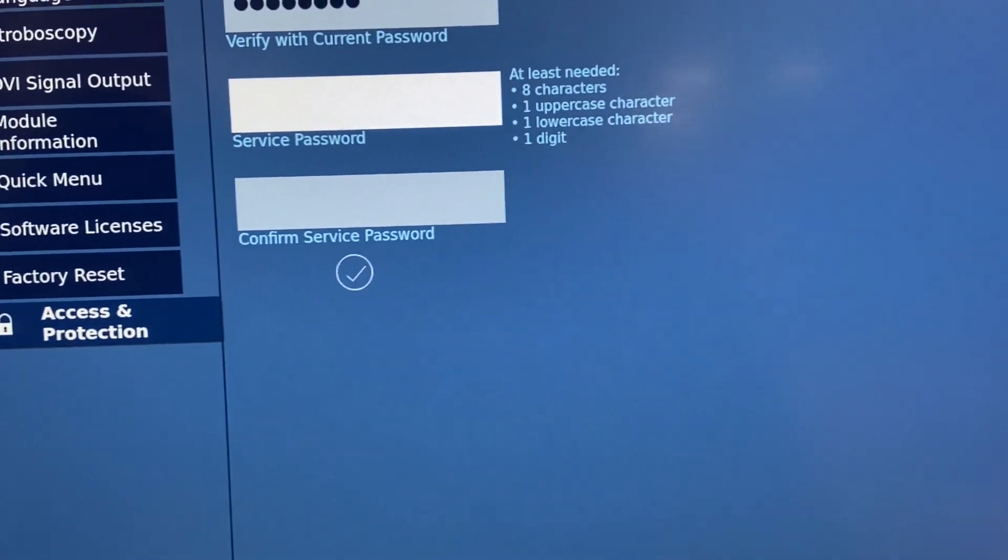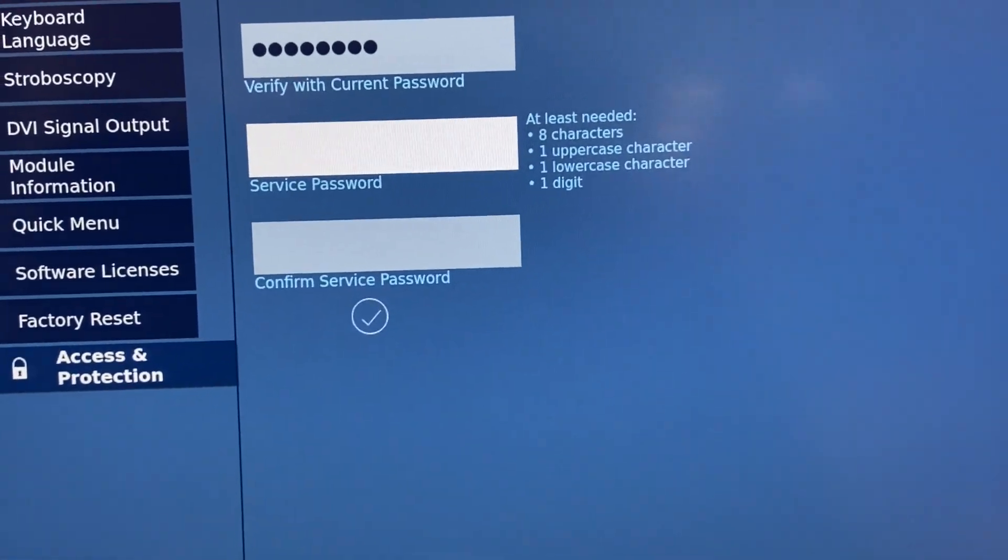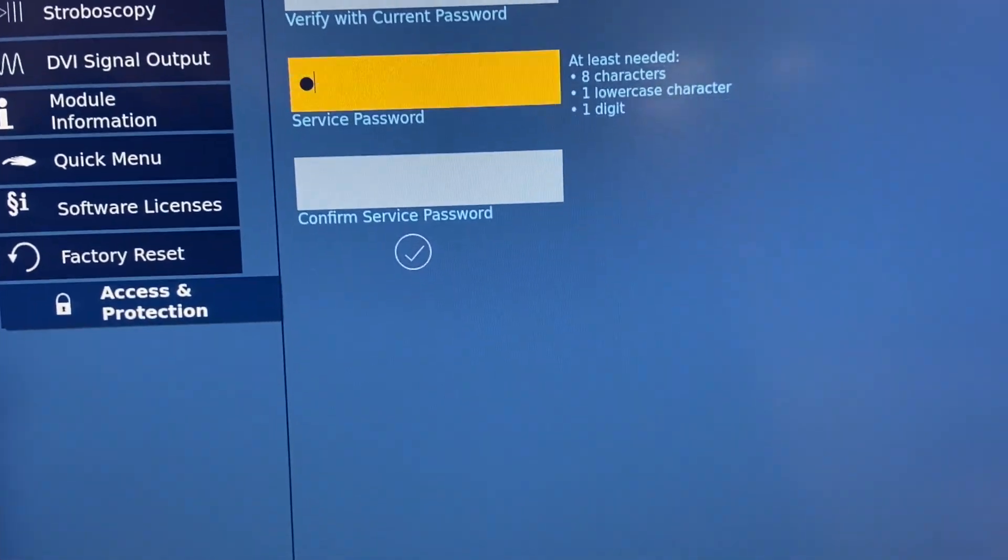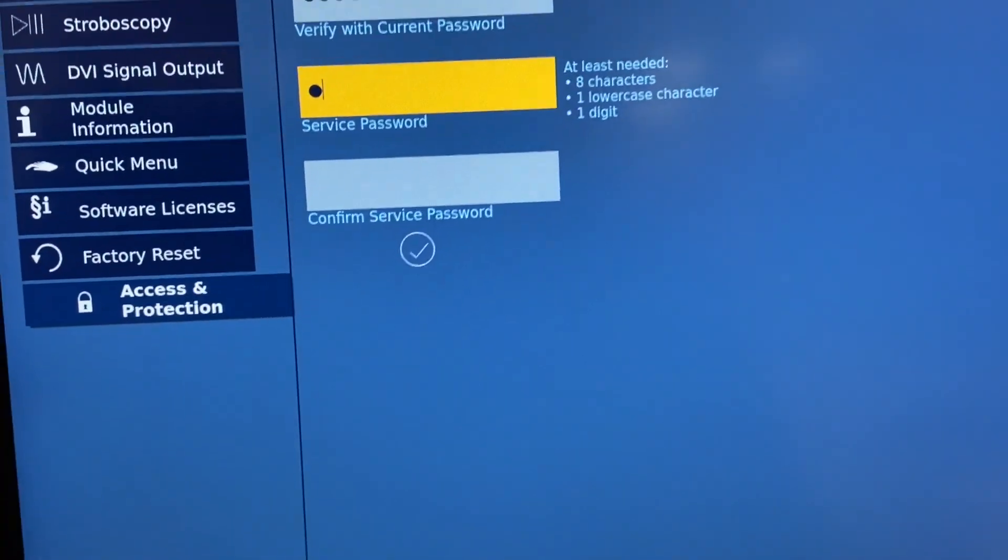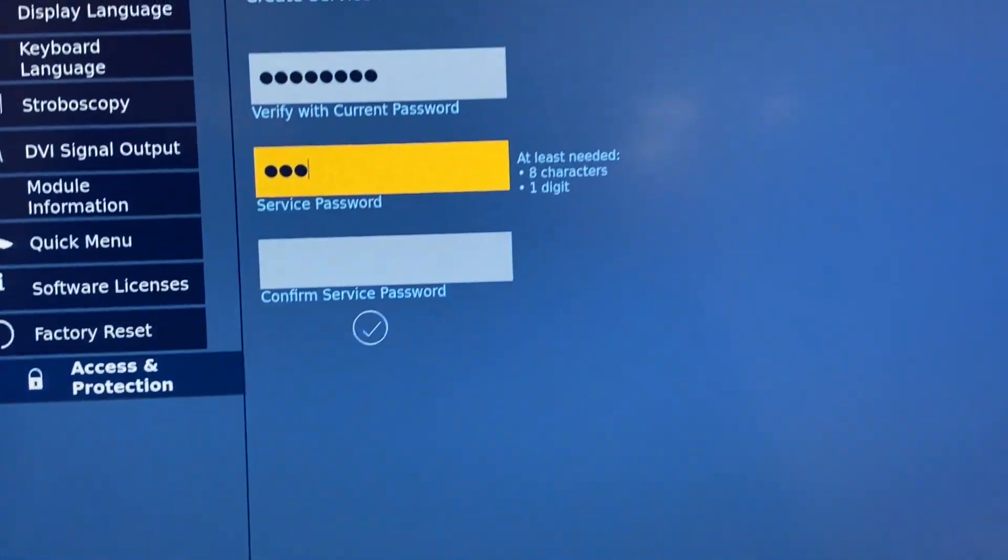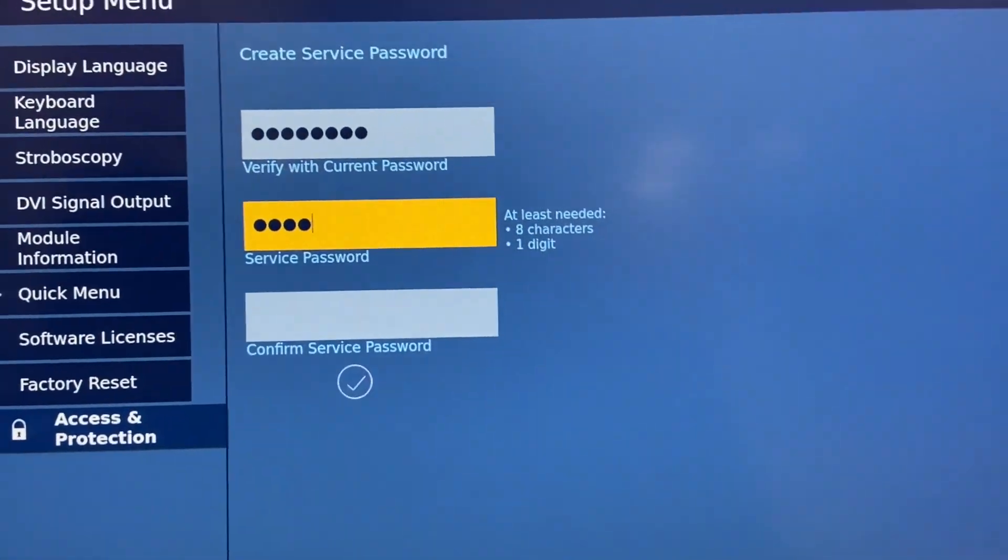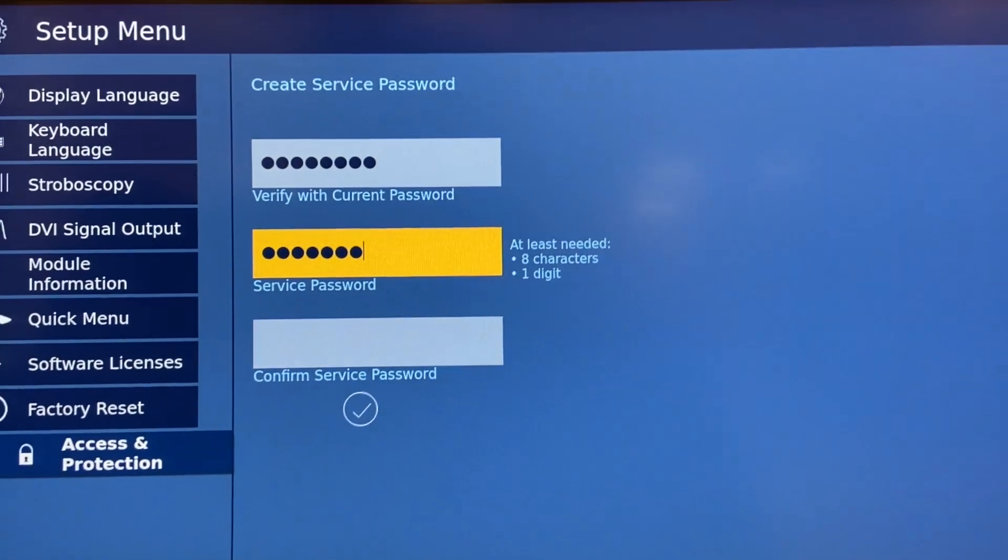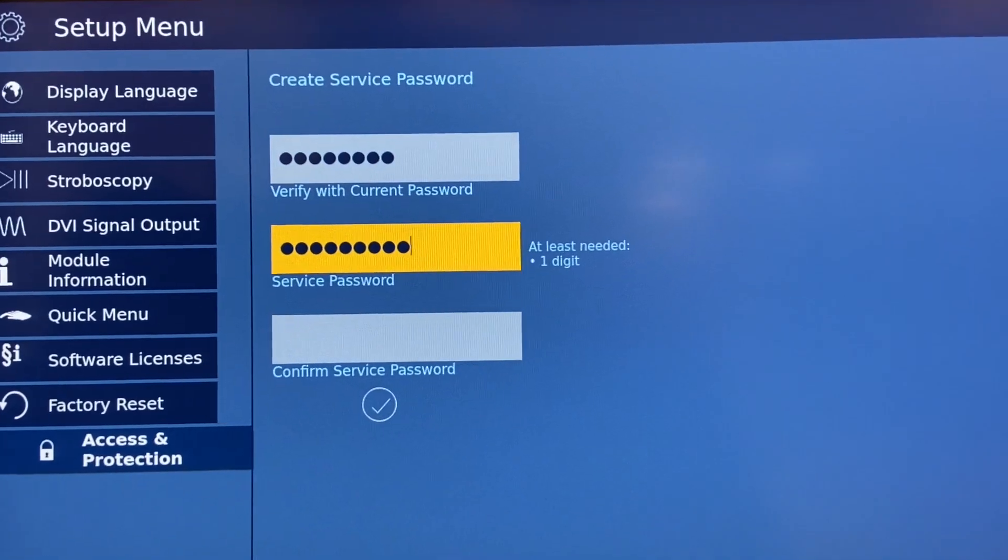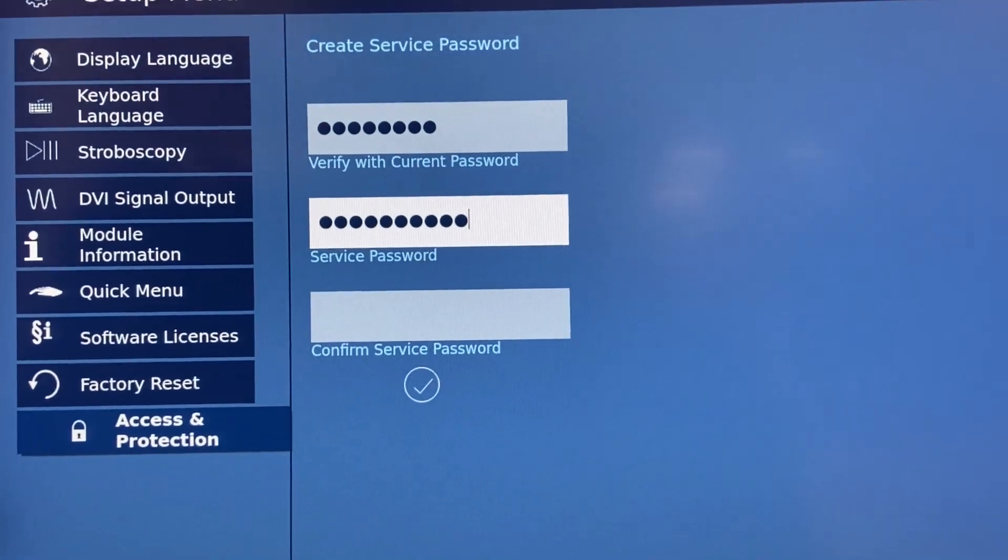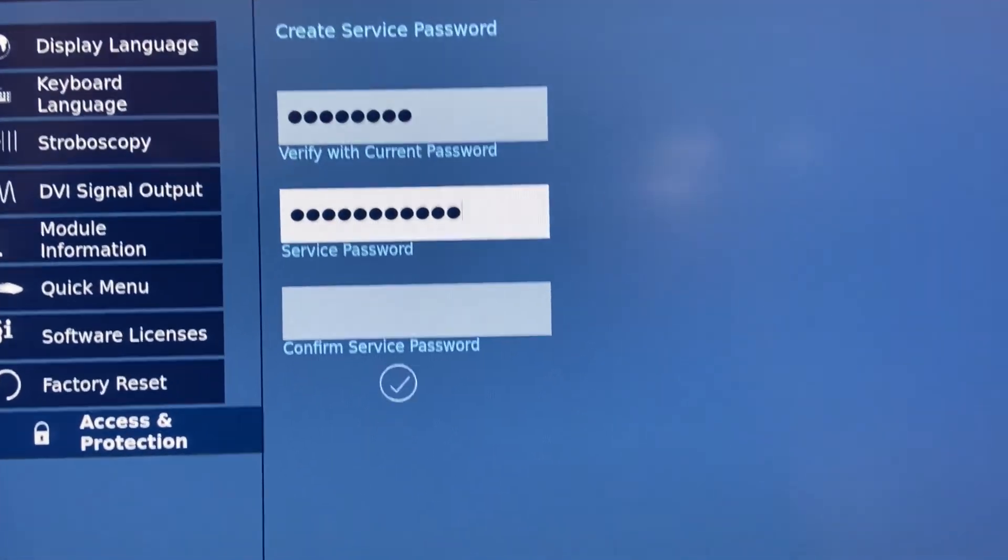Then when you create a service passcode, use capital K-A-R-L-S-T-O-R-Z-1, exclamation point.